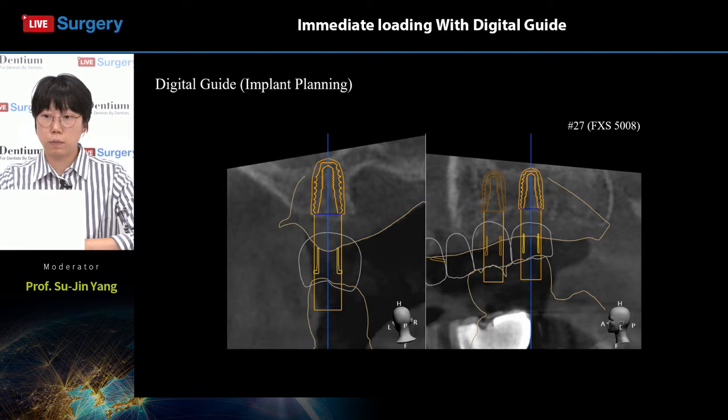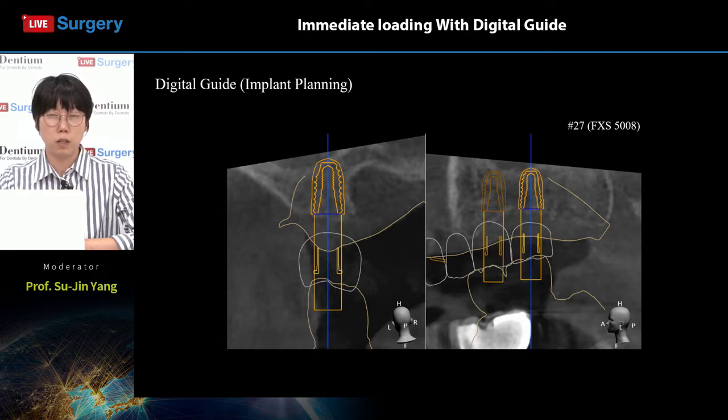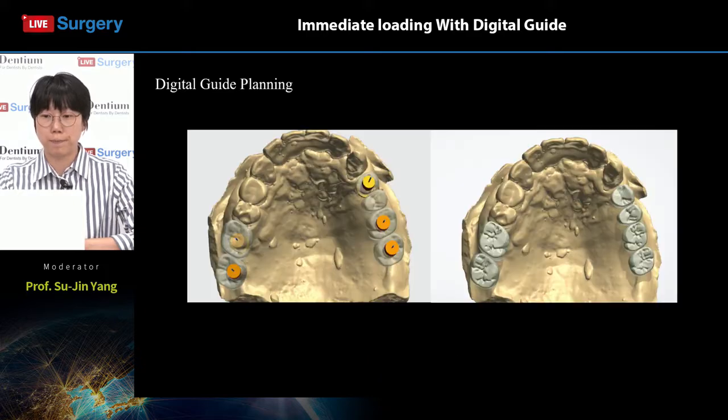density will be about D3 to D4 in most sites. So careful drilling to ensure initial stability will be important. In cases where the bone density is very low, initial stability is hard to get, and in devastating situations, the surgeon might not be able to install the implants and has to do a bone graft and try later on, which is a result nobody really wants.